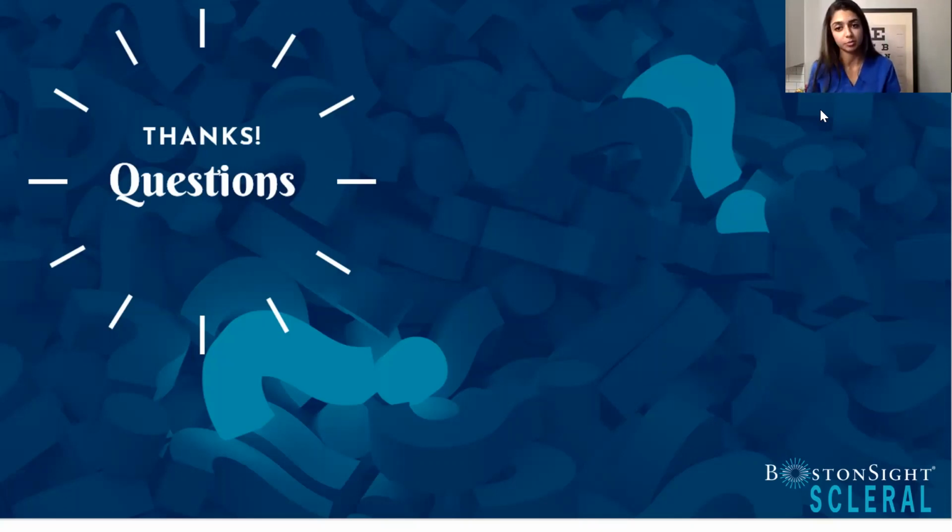We do have excellent support staff. So we have technicians that work up my patients. I have a protocol, a standard operating procedure where when patients are entering the door, there's about 6 to 10 different providers in the building at the same time. So if they know it's a Dr. Dave patient, this patient's getting an anterior segment OCT, they're going to the imaging department, they're getting their slit-lamp camera photos, and I'm really seeing that patient so that I have all of that data at my fingertips. And then of course, I'm fortunate that I have a scribe too. So oftentimes a lot of what I'm thinking or verbalizing is getting documented. So I think really having that 3-part of imaging support, technical support, administration support is key.